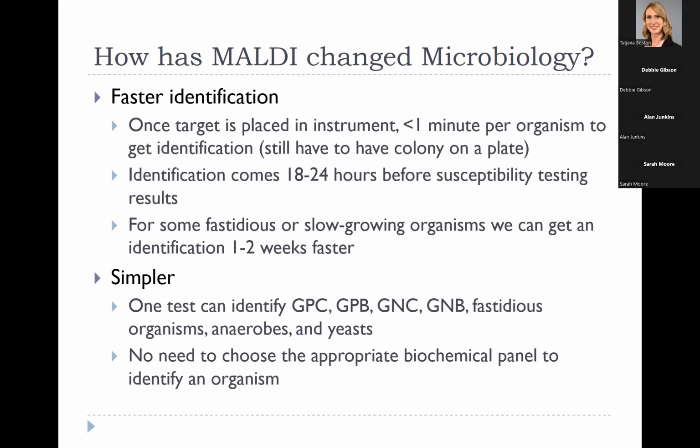Now we don't need to do that. Now we don't even gram stain. We see a colony on a plate. We think it looks like it might be important. You put it on MALDI, and you're done.